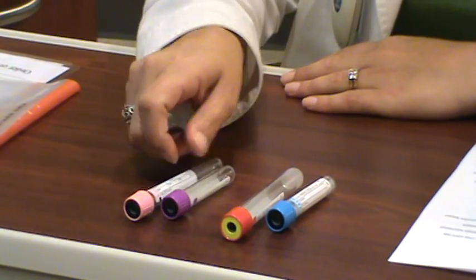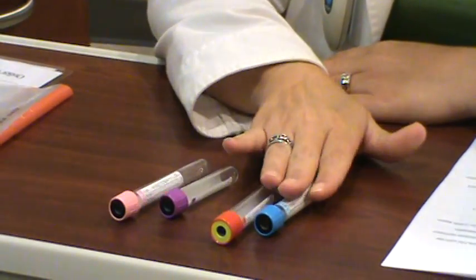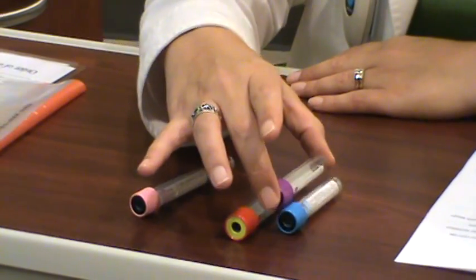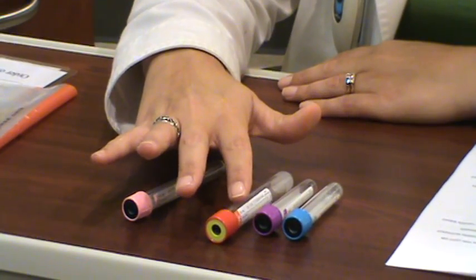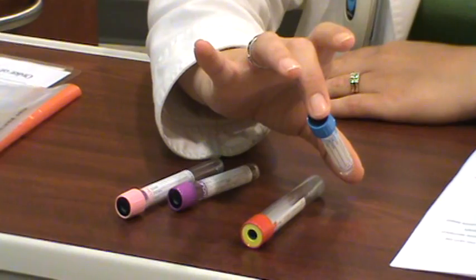The pink and purple can actually go in either order relative to each other. But it's really important that if we draw the purple one first, that's going to give us a low calcium result. So it's very important to draw the blue one first.